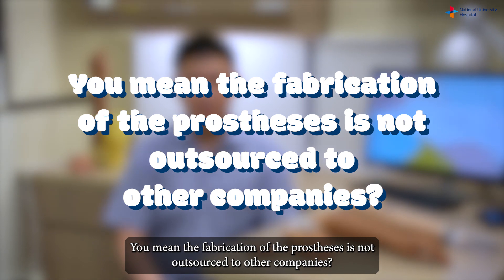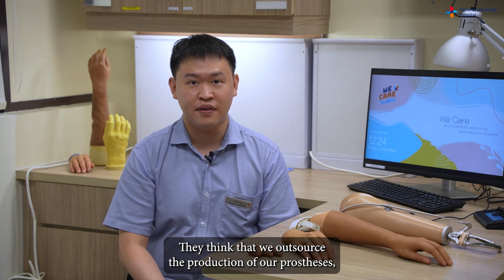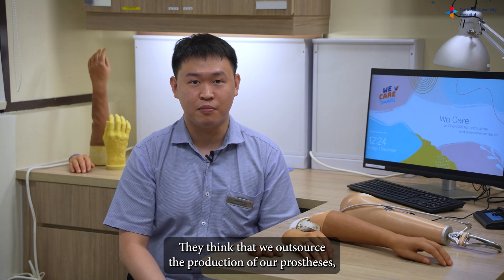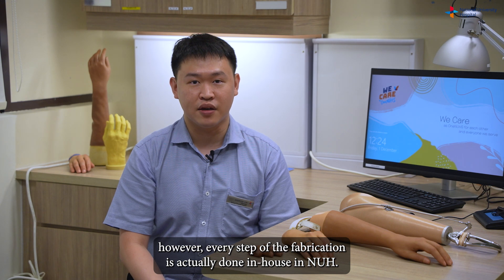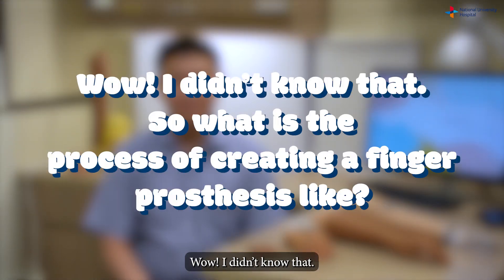That's a common misconception that a lot of our patients have — they think that we outsource the production of our prostheses. However, every step of the fabrication is actually done in-house here at NUH. Wow, I didn't know that!